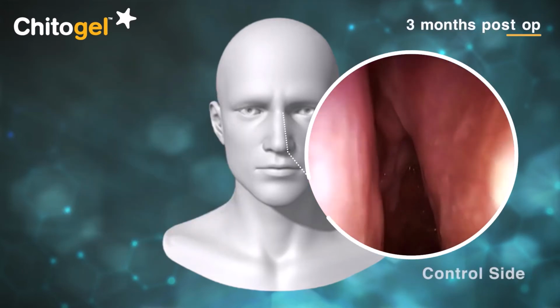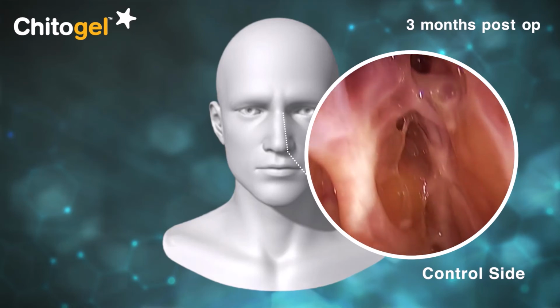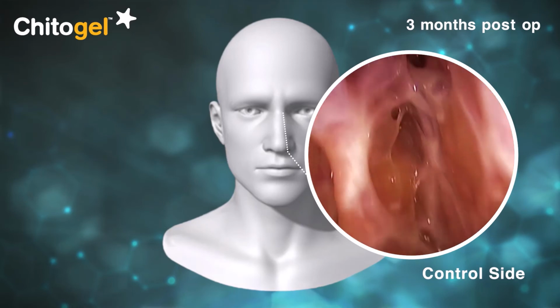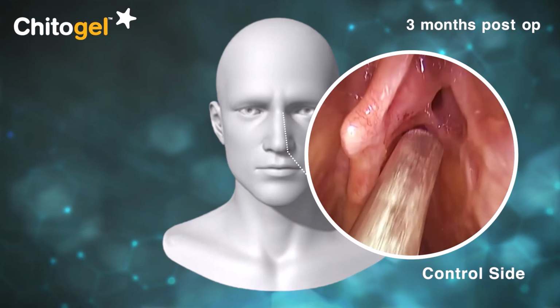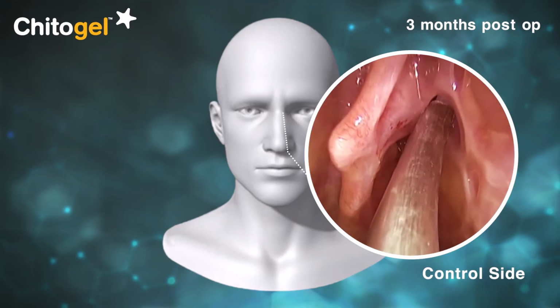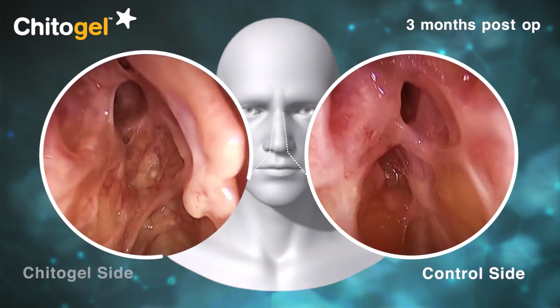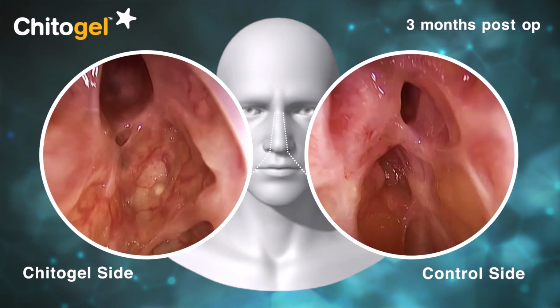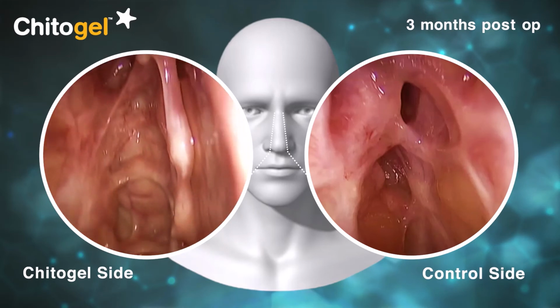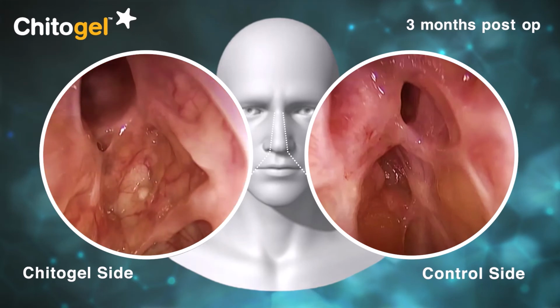When we review the patient at 3 months post-operatively, we can see significant secretions now in the frontal ostium, with significantly narrowed ostium and scar tissue bands around the ostium. When we clear away the secretions, we can see a patent narrowed frontal ostium. When we compare this to the right side, we can see a widely patent frontal ostium that is well preserved with healthy mucosa around the frontal ostium and less scar tissue formation in the ethmoid cavity.